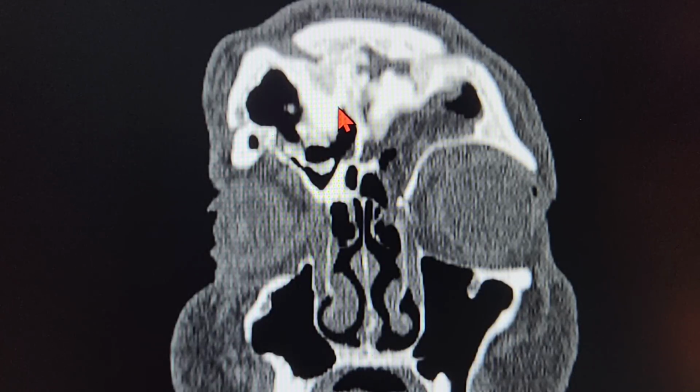This could be either because of the transcranial approach where they had drilled off the bone, or it could have been because of trauma. The road traffic accident may have led to multiple bony fragments which healed in an irregular way. There's no history as such regarding that point, so we may assume either of the two could have happened. But you can see the frontal sinus is very narrow in terms of space on this patient's right side.